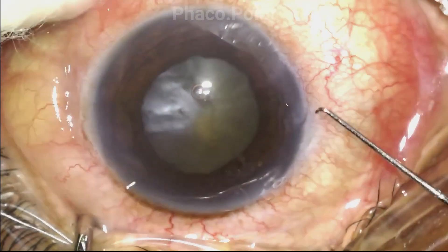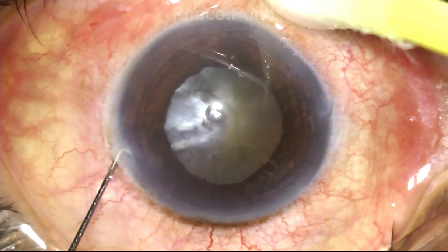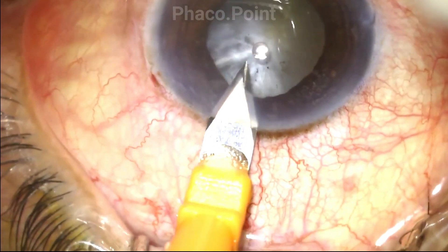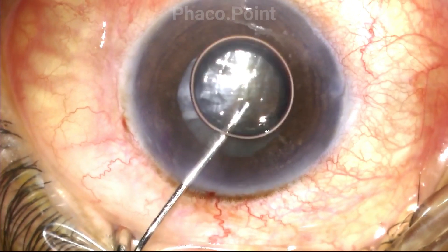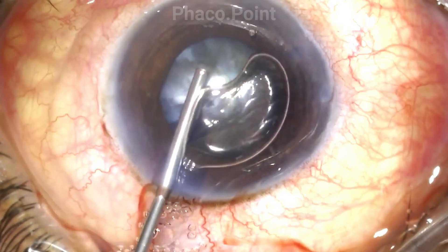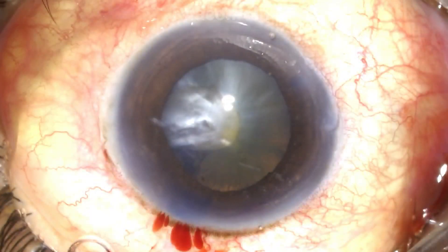Let's now move to the surgery itself. At the outset, you need to define where the side port incisions were taken by the primary surgeon. Since there was no 2.8mm incision created, I first go ahead and create a 2.8mm incision at a point that suits me. I take adequate time to stain the anterior capsule because I need to be able to see it clearly. After suitably staining the anterior capsule, I'm able to ascertain exactly what the status of the anterior capsule is.